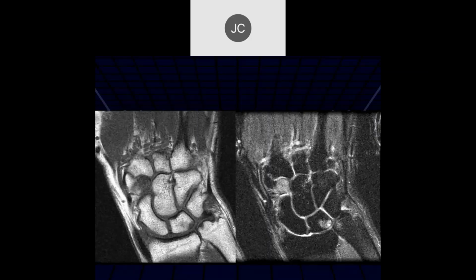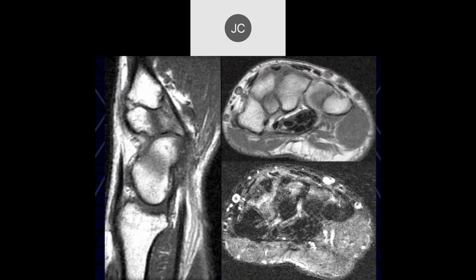Okay, Robert? All right. Here it looks like there's a lot of edema within the trapezoid bone. So I'd be concerned about injury there. And there's also a lot of cystic change in the proximal lunate and distal ulna. So we'll talk about ulnar abutment probably in the next lecture. So that's just a trabecular bone injury of the trapezoid. And then here we can see other fractures here. That usually heals with immobilization. Doesn't need surgical stuff.